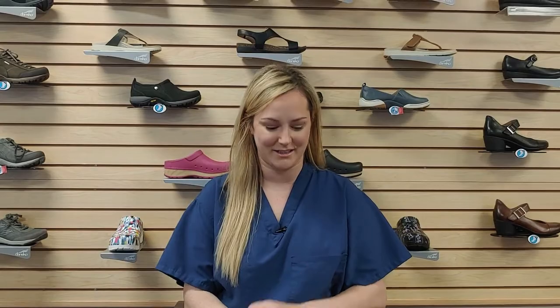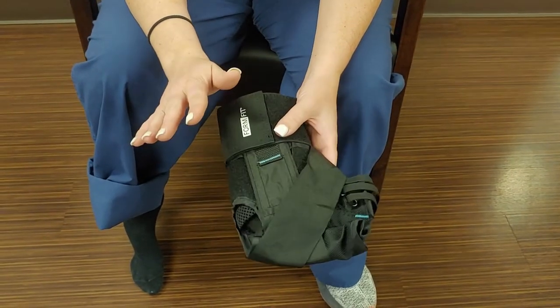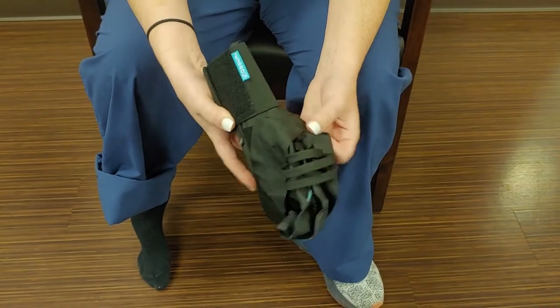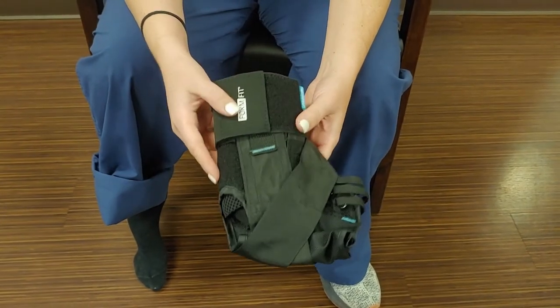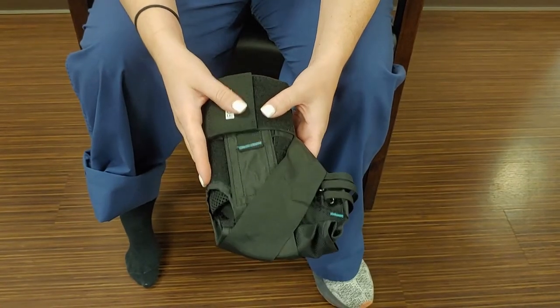Hi, I'm Dr. Pruner and today we're going to be talking about the Gameday Brace. The Gameday Brace can definitely be intimidating — it's got a lot of straps and things — so hopefully this video guides you on how to appropriately put this on depending on what you're needing it for.